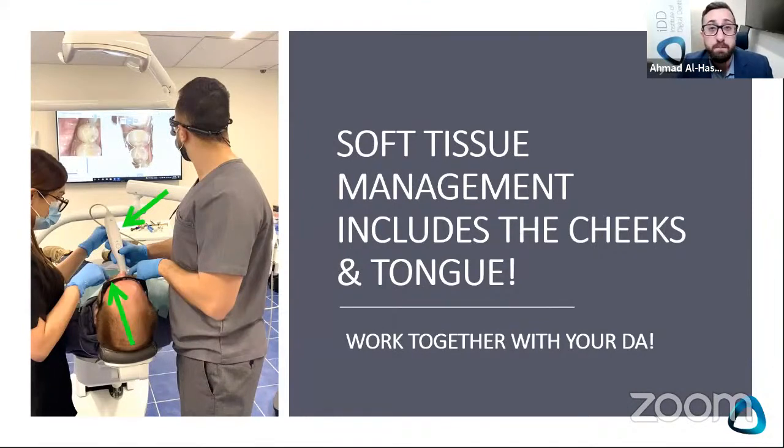Look at where the DA is looking. She's not looking into space. She's not daydreaming. She's looking exactly into where I'm scanning, because she can warn me if there's a bit of blood, or if something gets in the way or anything like that. The key thing that you're looking for is the scanning image on the computer, because that's going to tell you what you've captured. There's no benefit of you trying to look into the mouth with all this in there.